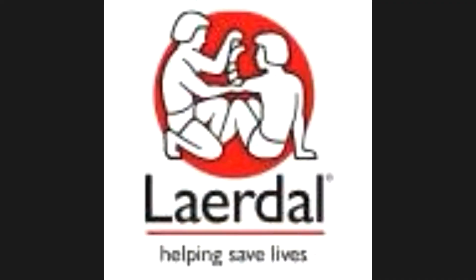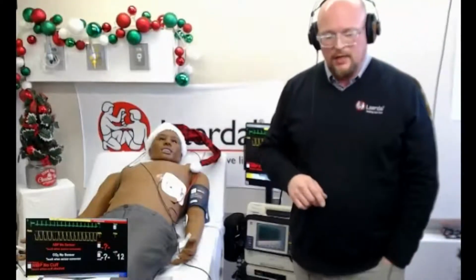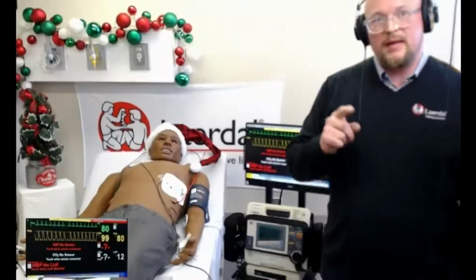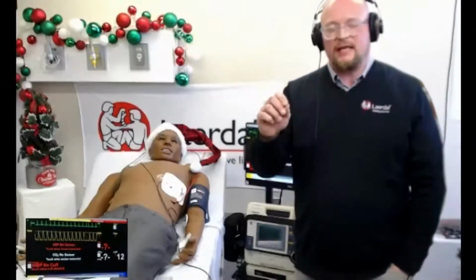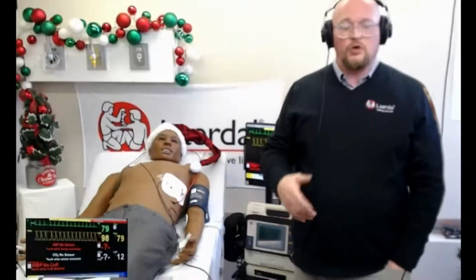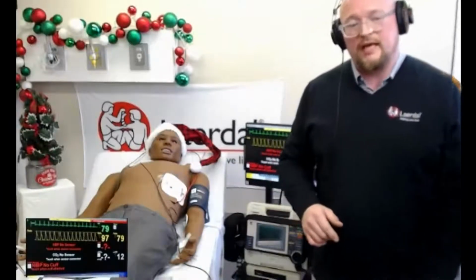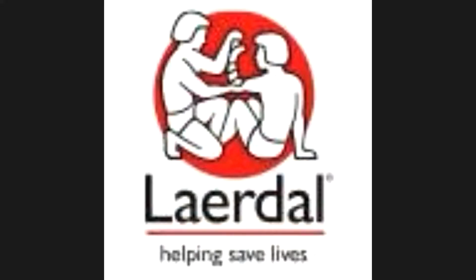Yeah, so we're going to cover that. For the SimMan 3G Plus, we're not going to be able to have that option. But with the new SimMan ALS LiveShock and the new SimMan ALS non-LiveShock, it's using the ShockLink system. We are going to learn that we can actually take those pads now and do an anterior posterior position with the SimMan ALS. We're going to see that in a little bit. I just wanted to throw that out there in case there were others wondering about anterior posterior.